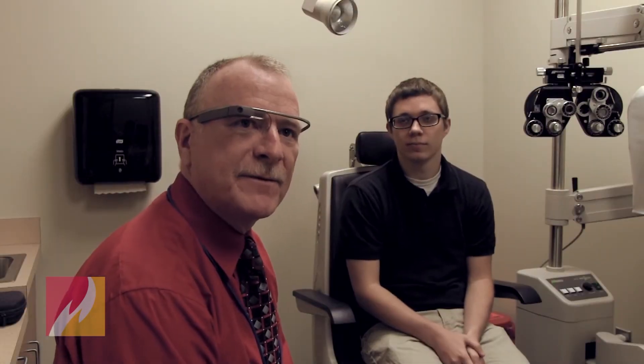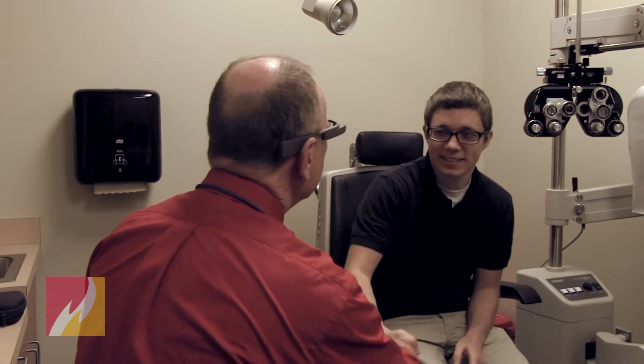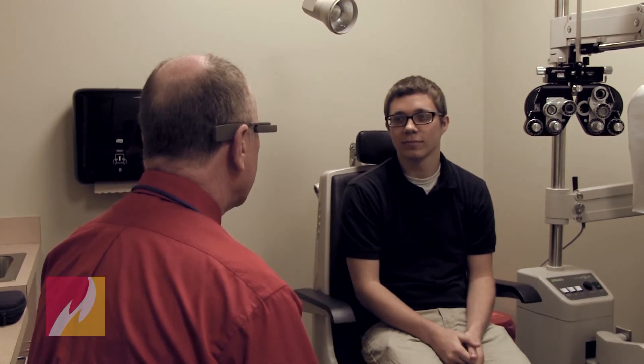Today we're going to attempt the first eye exam using Google Glass. I'm Dr. Morgan. I'm going to start out with a little case history, and we're going to record that. OK Glass, record a video.